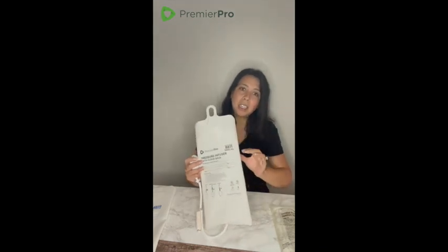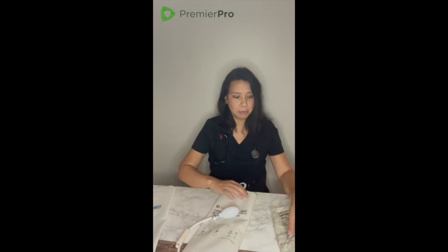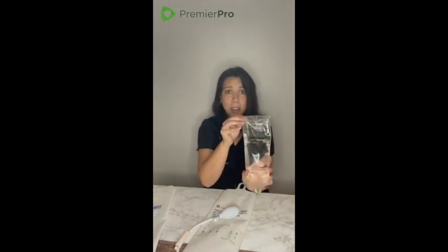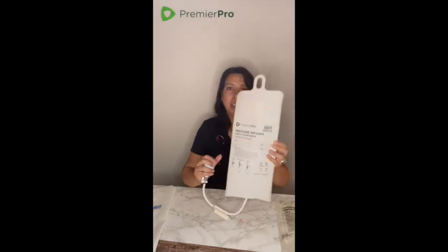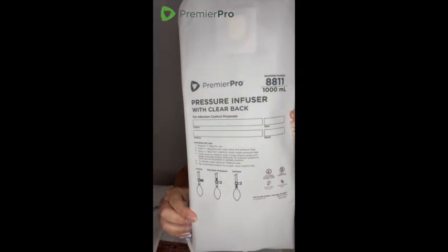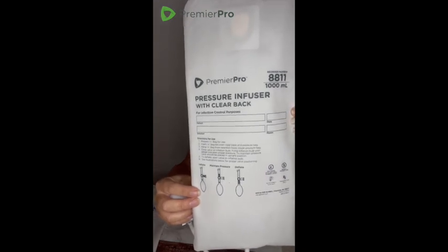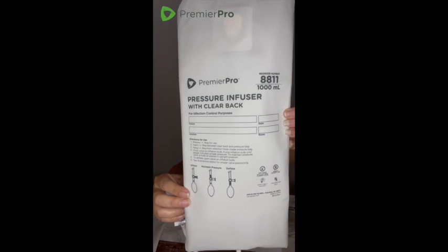I'm going to select the bag that matches the size of the IV bag that I'm infusing. Today we're going to be practicing on this 1,000 ml bag of LR. So I've selected the 1,000 ml pressure infusion bag. All the directions are printed on the bag, including the most critical step before we begin, which is making sure that our stopcock is in the proper position.